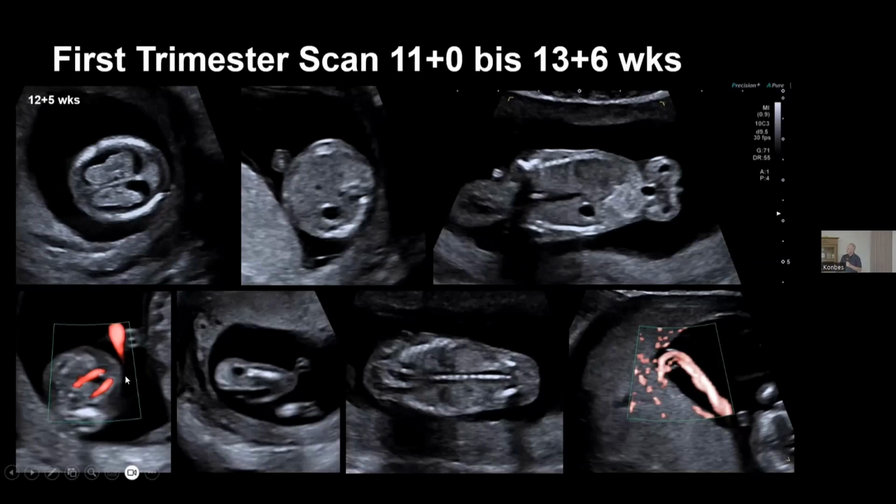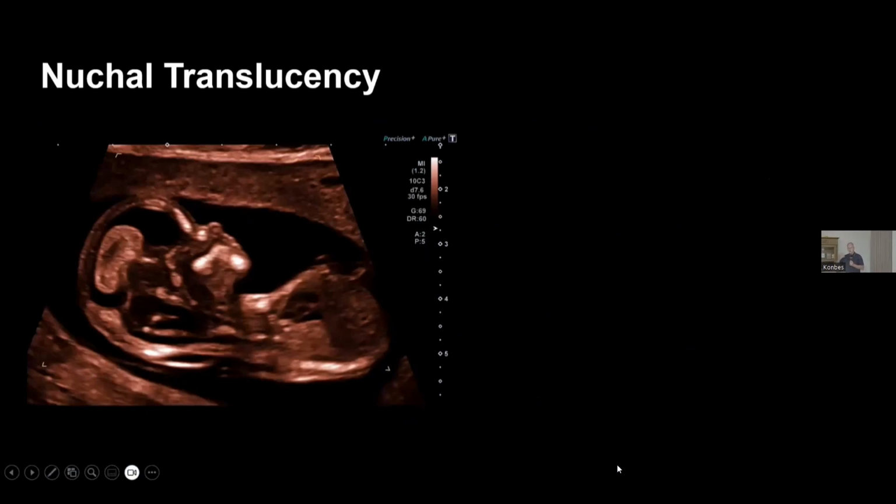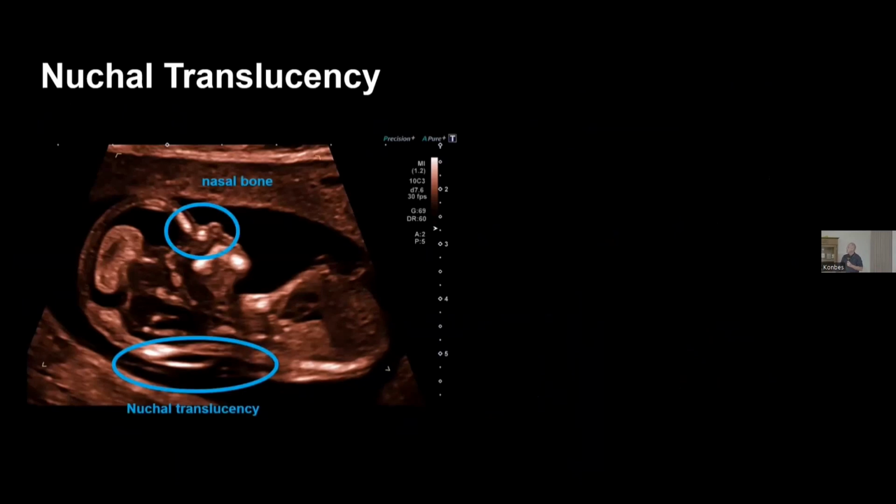We can also detect both umbilical arteries beside the bladder. We can evaluate the femur, the spine, especially the kidneys, and we can see also abnormal umbilical cord insertion into the placenta. So we have to look, and if we have ideas of what we can detect, we should do this. And this is the focus of my talk, because this is the development in the next 10 years, that we evaluate as soon as possible.